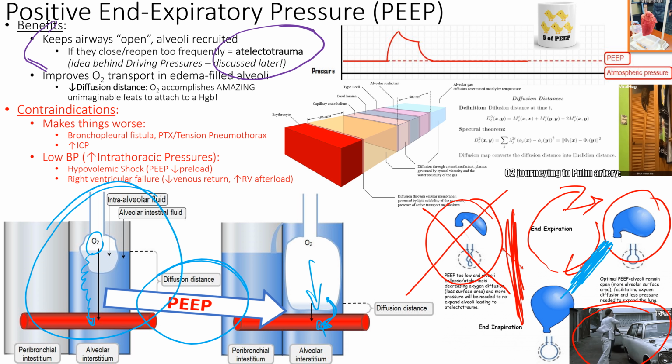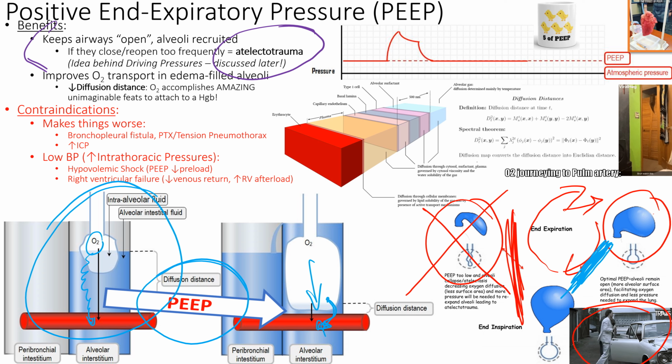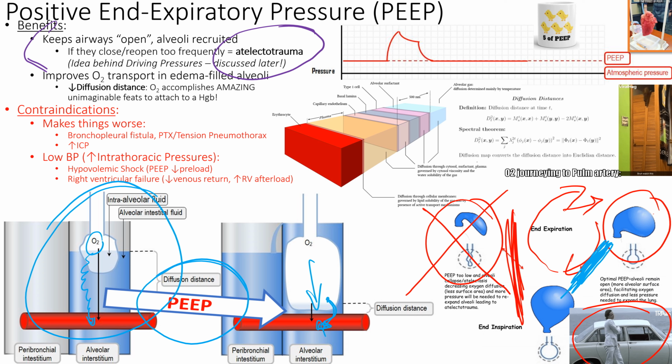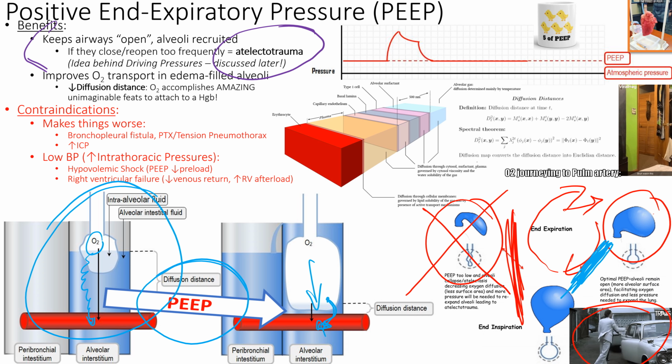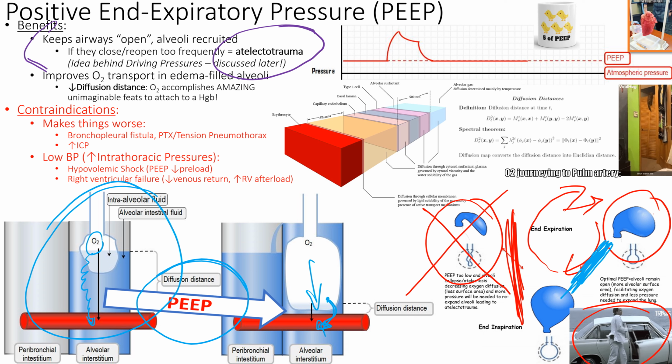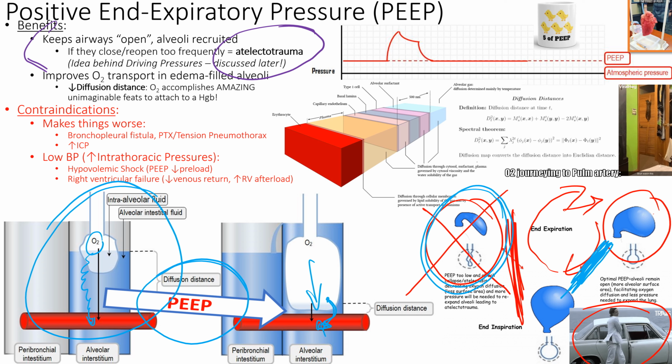Yes. So the atelectotrauma is just secondary to whatever the disease process is, and that's something that we do. Atelectotrauma is us. That's all us. So all these barotrauma and ventilator-induced lung injuries and all these things are due to us not monitoring the ventilator. So we can avoid that by having adequate PEEP, making sure that the PEEP is good, so we're not getting the PEEP all the way down to the point where we're causing the shut all the way, right? So we have opportunity to improve that, right?